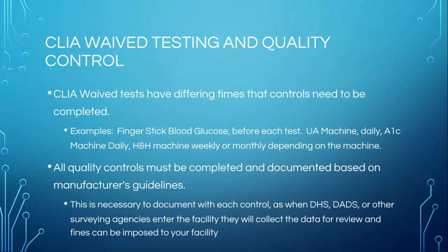There are machines where you collect a urine specimen, you put the dipstick in it, and you put it on a little tray that comes out. It goes back into the machine, and it reads the urine dipstick for you instead of you having to read it. And we'll look in a minute when we talk about UAs. You'll see a video on how they use the actual bottle from the dipstick to read a urine dip UA. There are also machines that will do that. Those have to be calibrated. Those actually have to be calibrated every day.